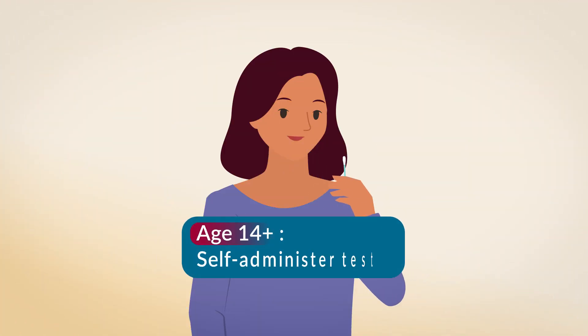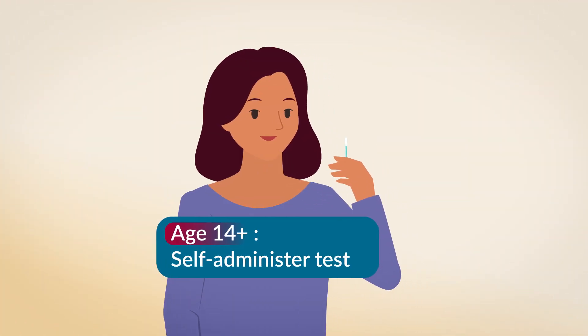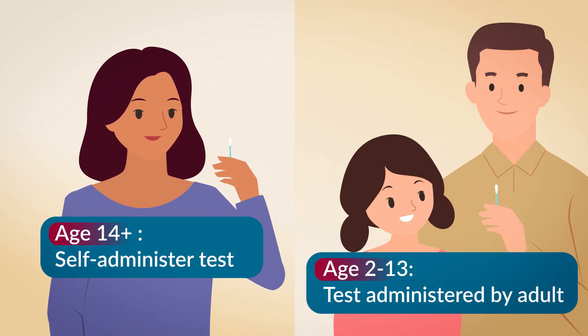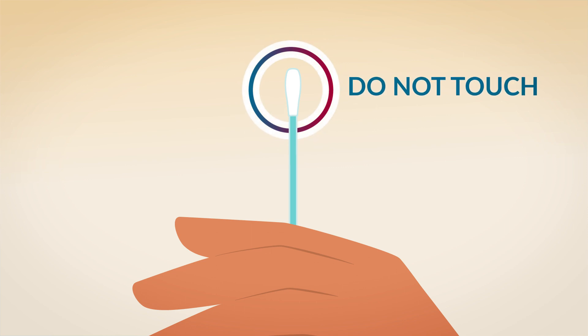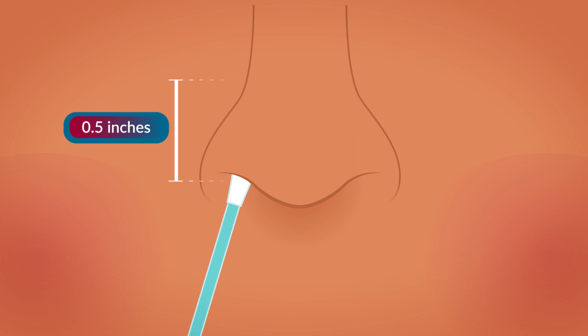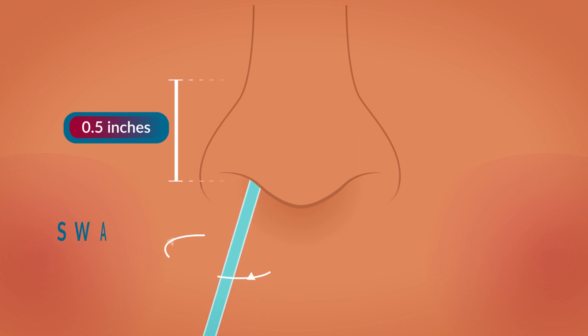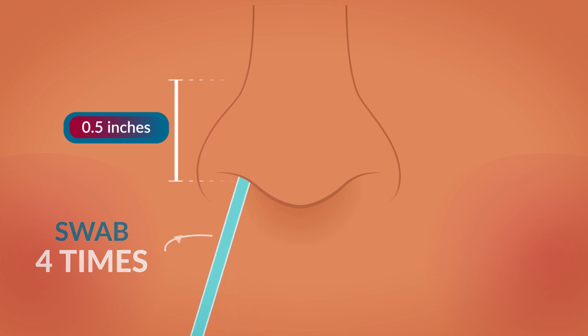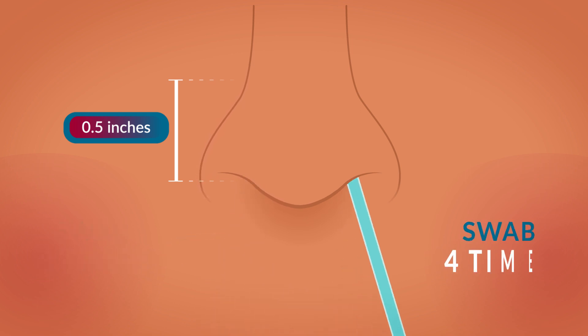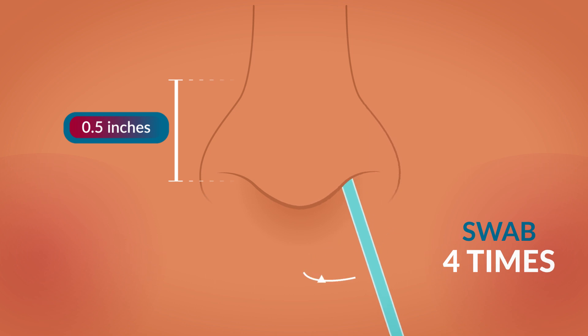If you are 14 years or older, you can do the test on yourself. Ages 2-13, an adult must collect the nasal sample. Take out one swab from its packaging. Be careful not to touch the tip. Insert the swab at least one half inch inside one nostril. Slowly rotate it at least four times as you rub it along the inside of the nostril for 15 seconds. Using the same swab, repeat this procedure in the other nostril.